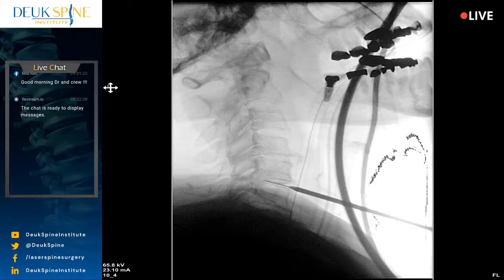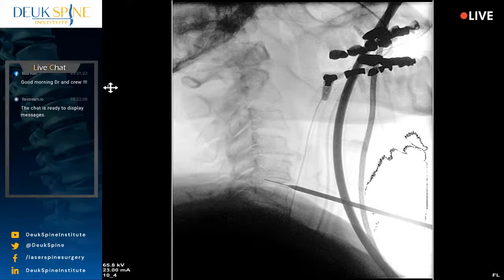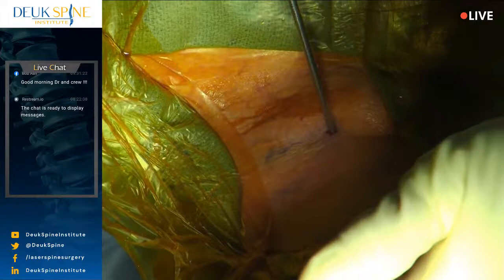So that annular tear has basically, can you stabilize her neck, please? Grab her head, put her in neutral alignment and a little bit of inline traction. So I'm going to have my anesthesiologist just stabilize the head, because every time I push down, the spine flexes a little bit. I don't want her flexing, keep her in slight extension, okay? You got her?